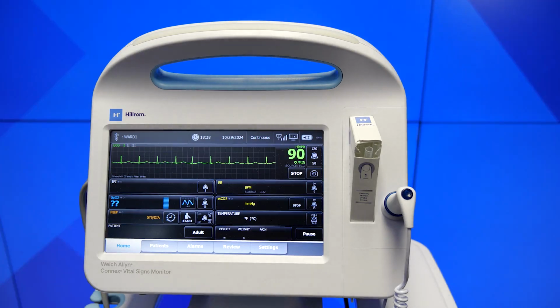Once the patient has been hooked up, touch Start in the ECG frame to begin acquiring an ECG waveform. Allow 3 to 5 seconds to pass before the waveform appears on screen. The heart rate will also appear in the ECG frame. Locate the ECG lead label in the frame. Look for a list of available leads with the current lead selection highlighted.